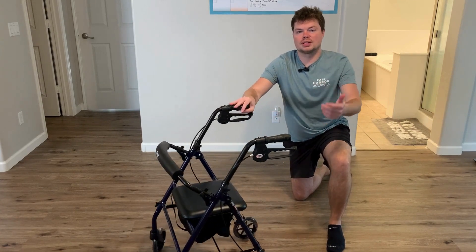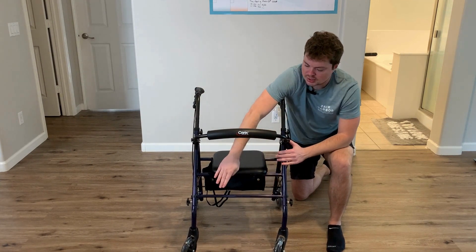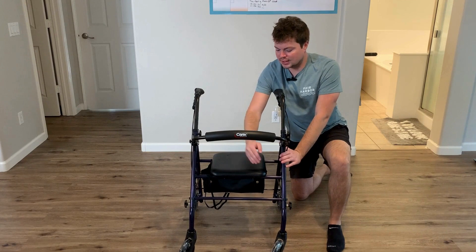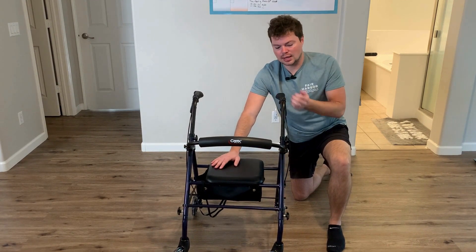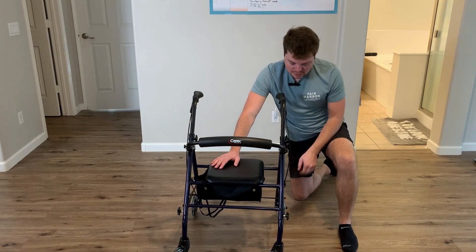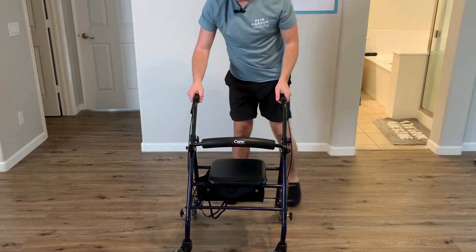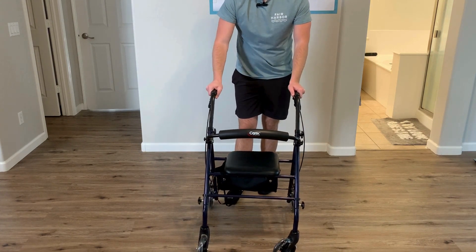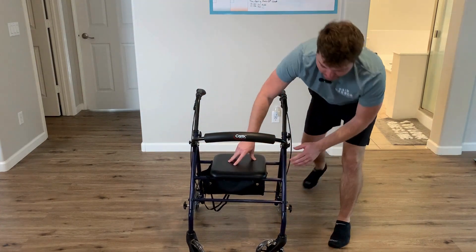Now for the second question — what are the actual dimensions of this walker? I measured it fully across from wheel to wheel and it is about 20 inches in width. The seat is 12 by 12. Right now I have the handles as high as they go extended, and from the floor to the handle it's about 35 inches. I'm about six feet in height, so this is what it'll look like — plenty tall for me, and the maximum handle height is 35 inches from the ground.